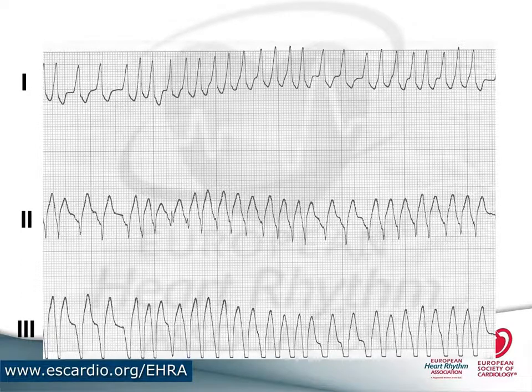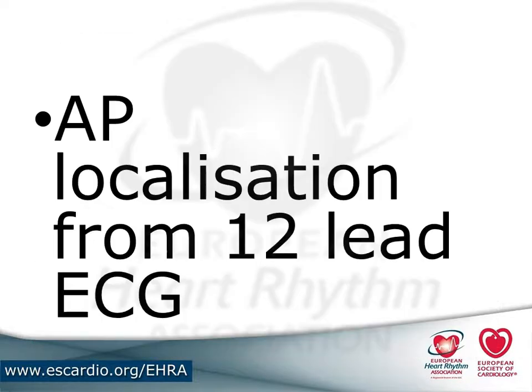My hint here is always: if you see this kind of ECG and the patient is still talking to you, then it's more likely not VF. If the patient is no longer talking to you, get really scared and act fast. You still need to act fast in AF with WPW, but nevertheless, if the patient talks to you, that's a good sign. Then you have a little bit more time to think. But my advice is, if the QRS complex is broad, better be scared. Tell everyone in your hospital, better be scared. And the emergency room people need to know that they better act as if it's AF with WPW. Obviously, this is not VT.